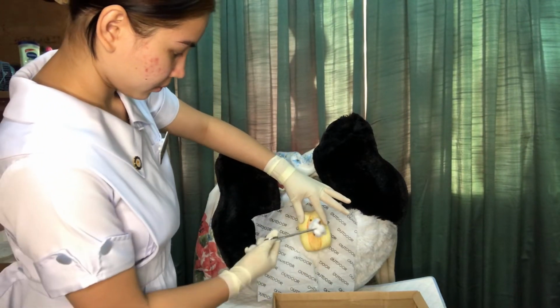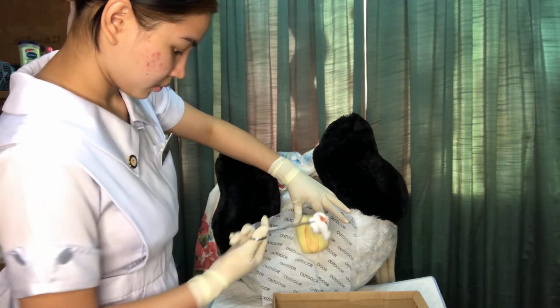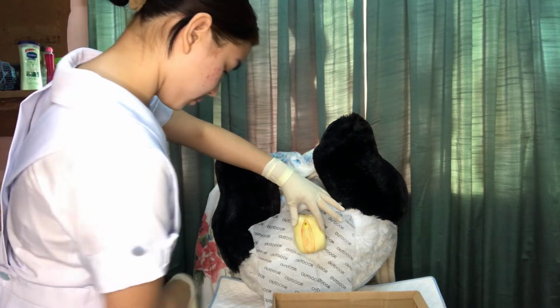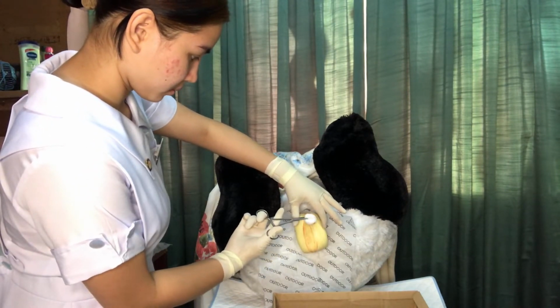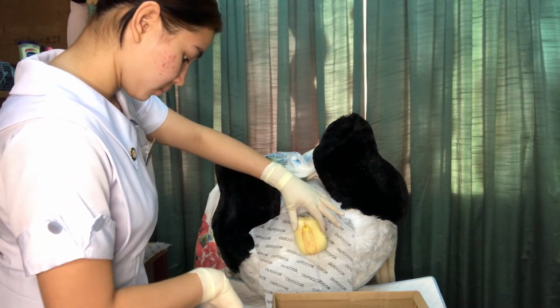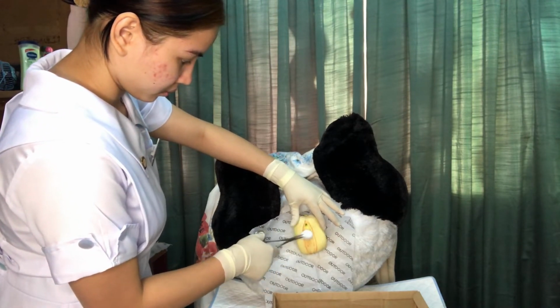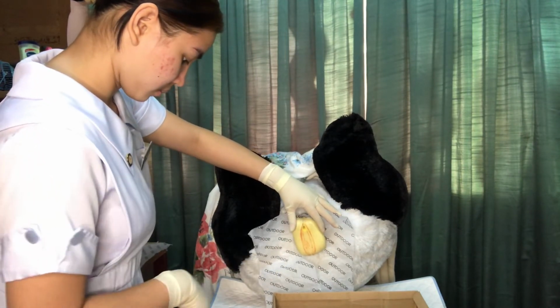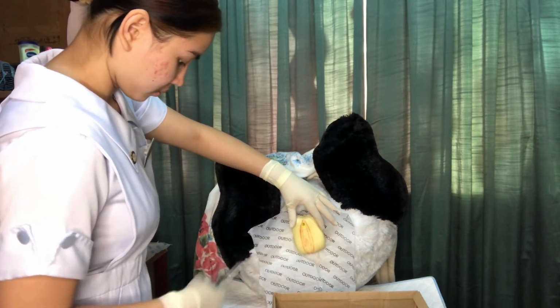So separate the labia minora to visualize the urinary meatus. Cleanse around the urethral meatus with antiseptic solution, using a downward stroke from anterior to posterior. And then we're going to dispose of the cotton after each use. So again, this one is an aseptic method, so we're not going to reuse the cotton balls when we wipe the other side of the urethral meatus.